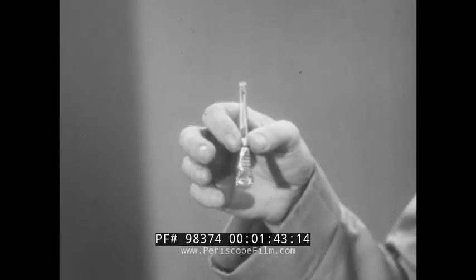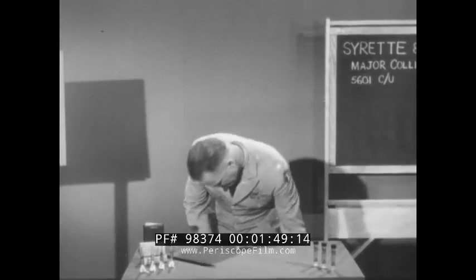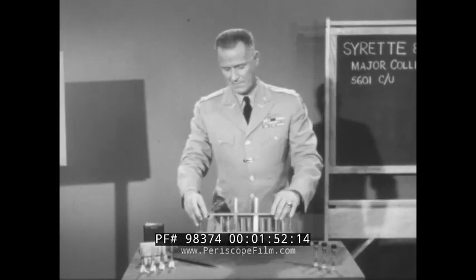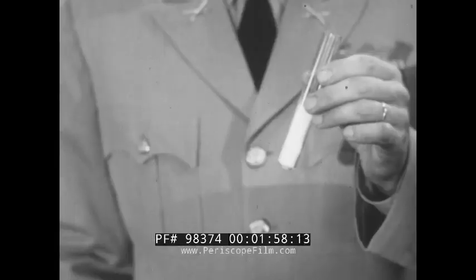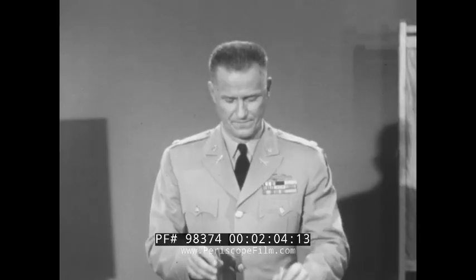Now in this container is your atropine syrette. And here's what's in the syrette: atropine, a crystalline drug and a powerful one. It is itself a poison. Here it is in liquid solution, as we will find it. Atropine is not new, being known to the medical profession for over 400 years. You've heard of atropine as the first important item of self-aid in defending yourself against the effects of nerve gas poisoning.